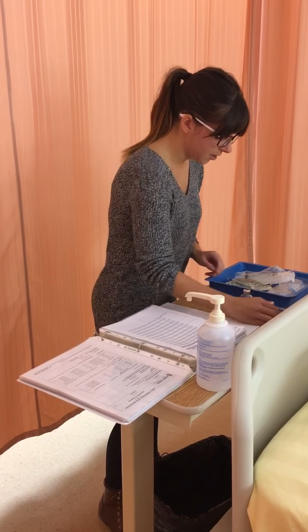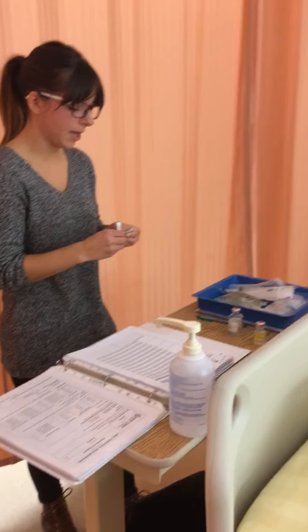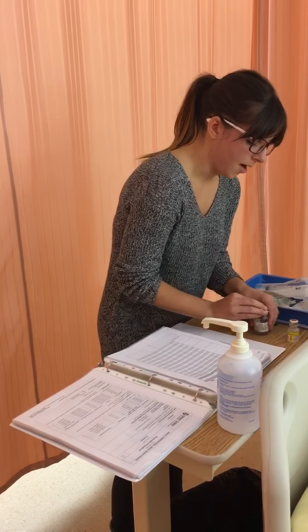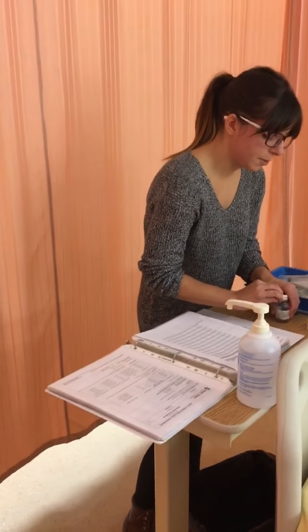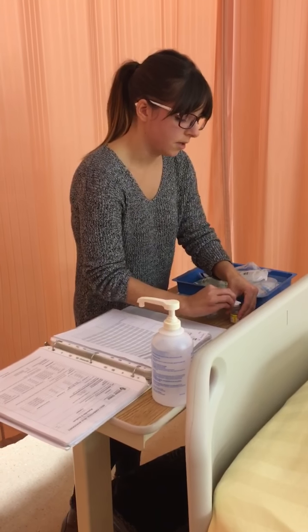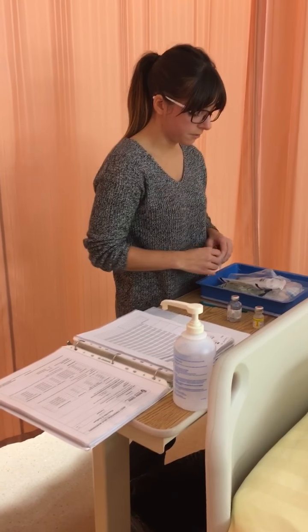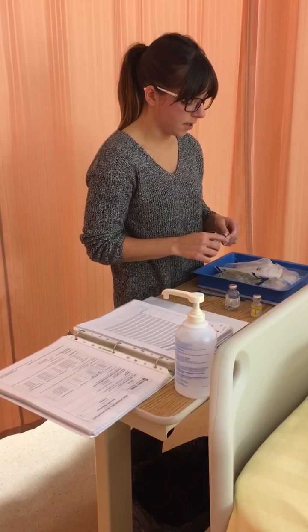Now I'm going to sterilize the vials, my drug as well as the normal saline, before beginning to withdraw the medication, maintaining that sterile vial. So I'm going to swab for 30 seconds and let dry. For the purposes of this video, we're just going to say that that's 30 seconds. Alright. Now I'm going to grab my 10 milliliter sterile syringe and put the needle on the end here.